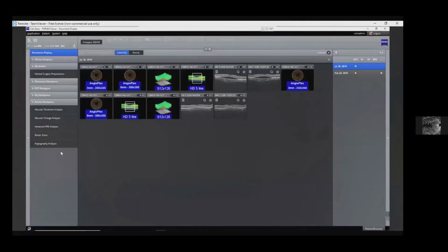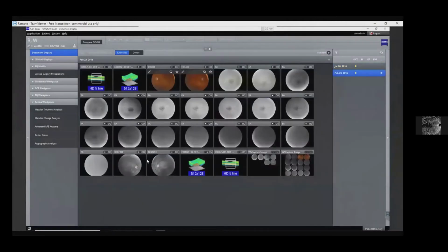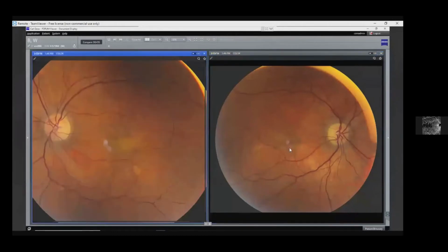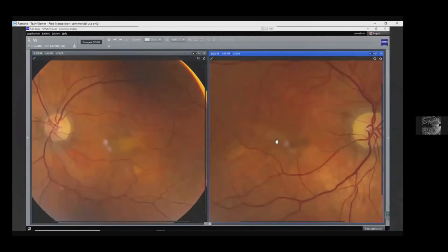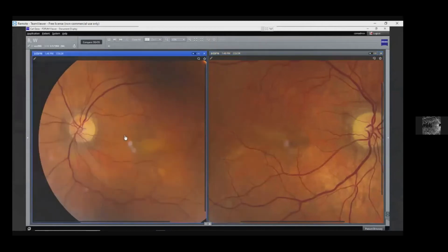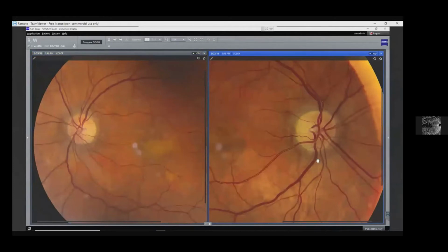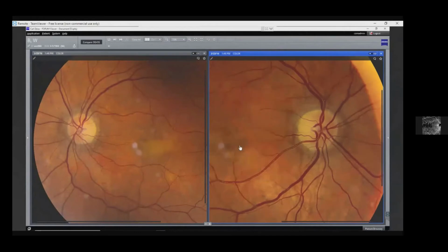This is patient BW. It's actually a patient who originally saw one of my partners back in February of 2016. I'm going to show the fundus photographs here first. And so what we see here is some vitelliform-like debris here in the central macula, kind of in a pseudohypopyon appearance with some RPE changes. Also, if you look carefully at the optic nerve, you'll see that there is this reddish concentric ring around the optic nerve with some radial extensions in both eyes. And so what those are, as I'm sure everyone's aware, is angioid streaks. This is a patient who has angioid streaks with the associated vitelliform dystrophy.